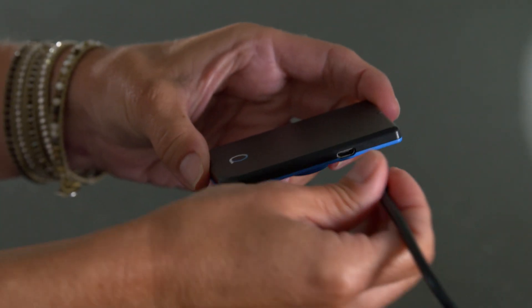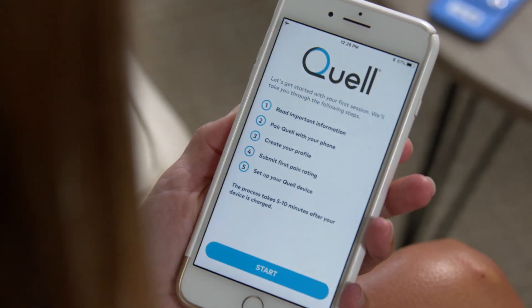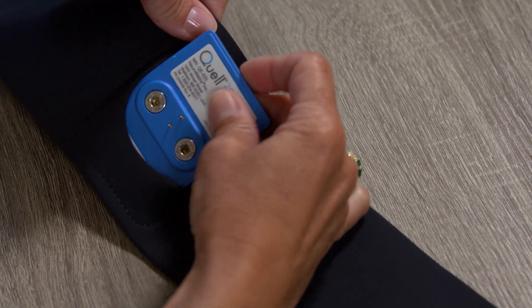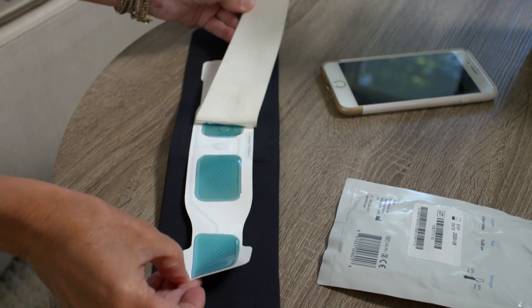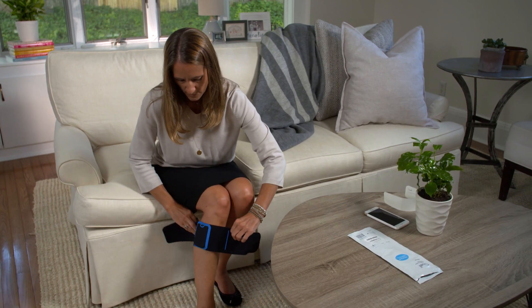By this point, you should have already charged your Quell 2.0 device, downloaded the app, and followed the steps to put on your Quell. These steps include inserting the device into the back of the band, snapping the electrode in place, removing the liner from the electrode, and wrapping the band around your upper calf 1 to 2 inches below the knee.